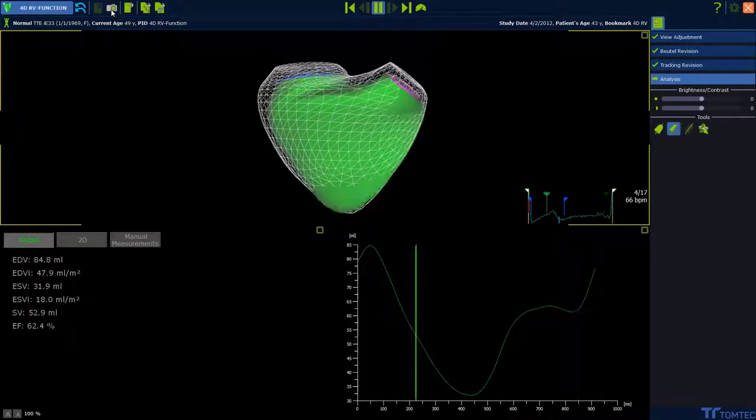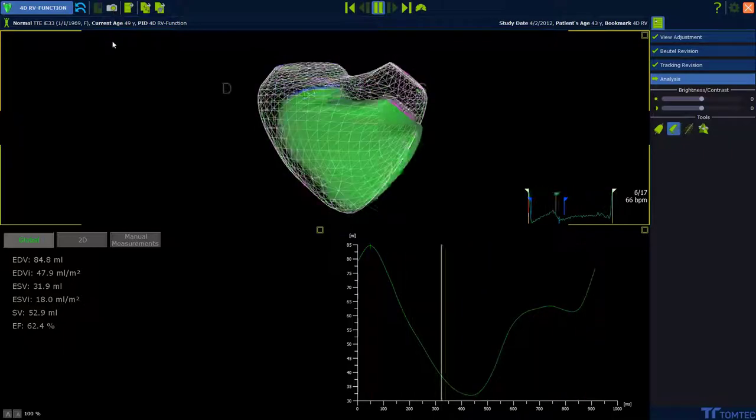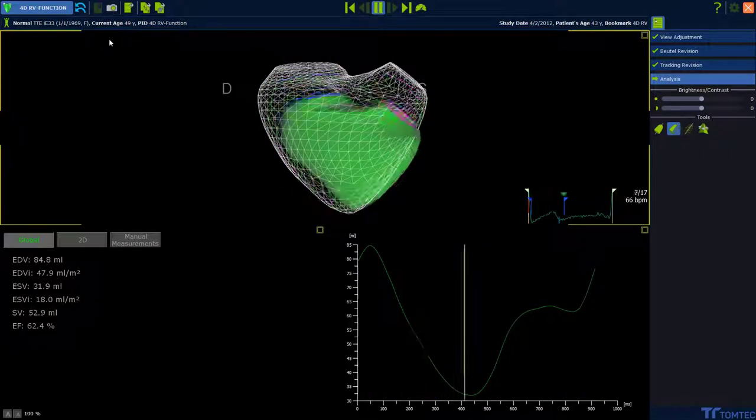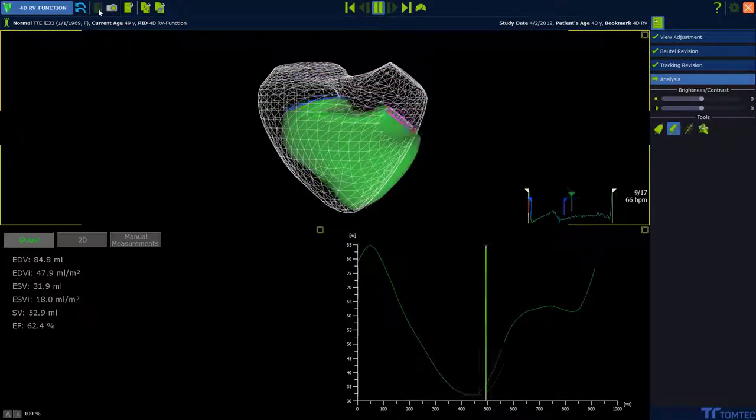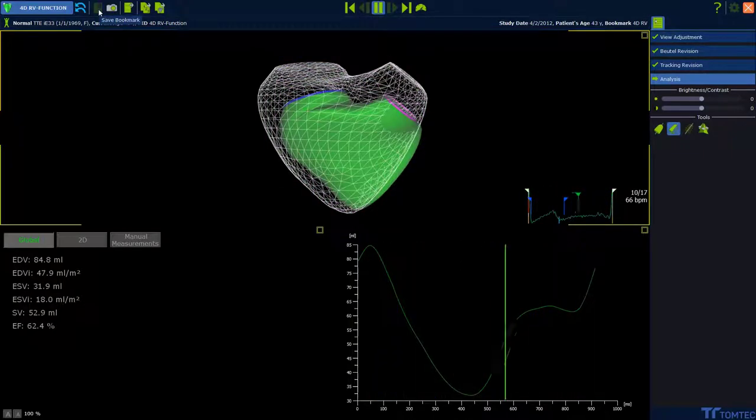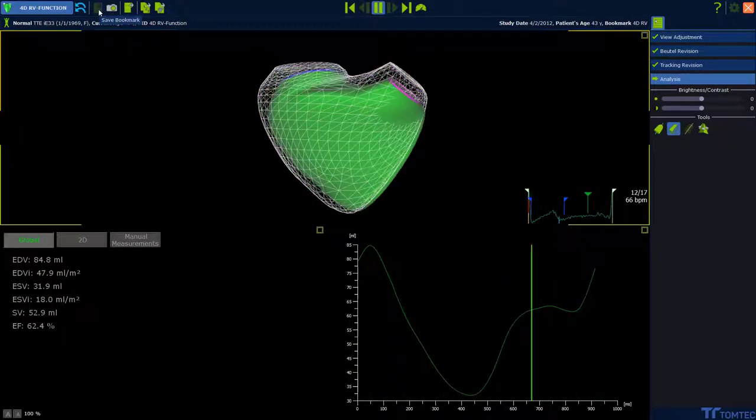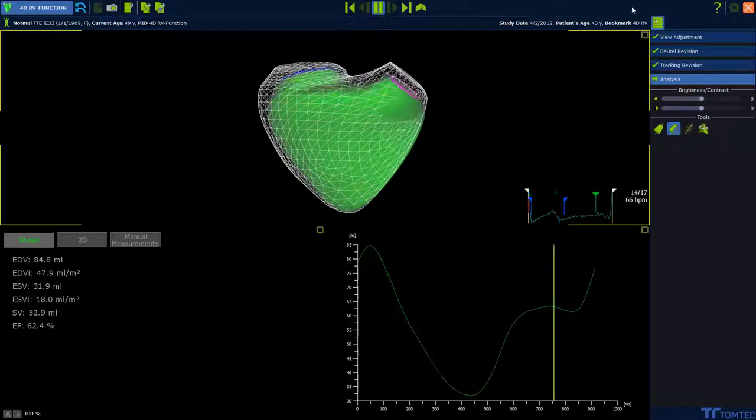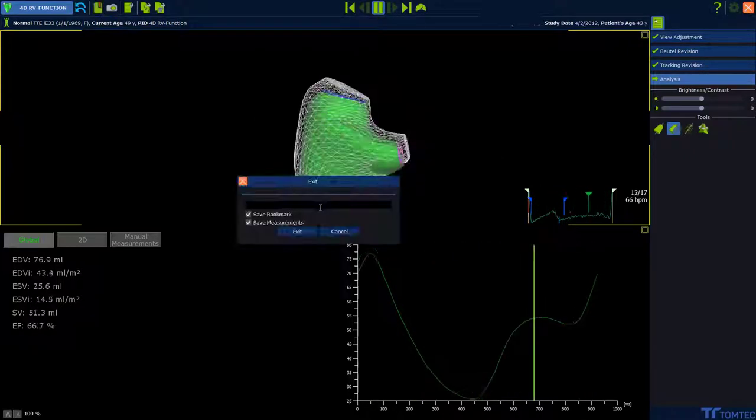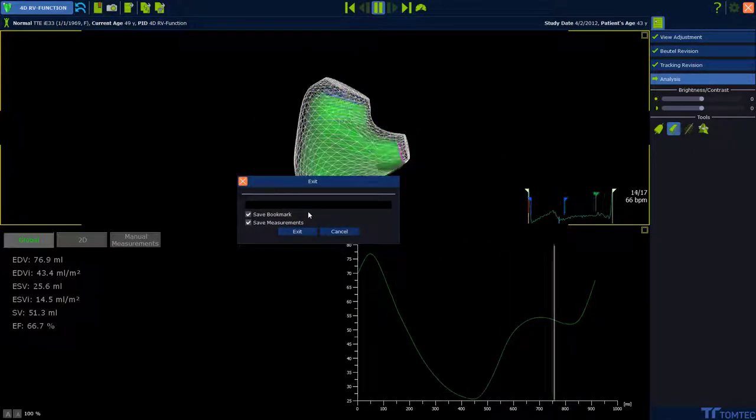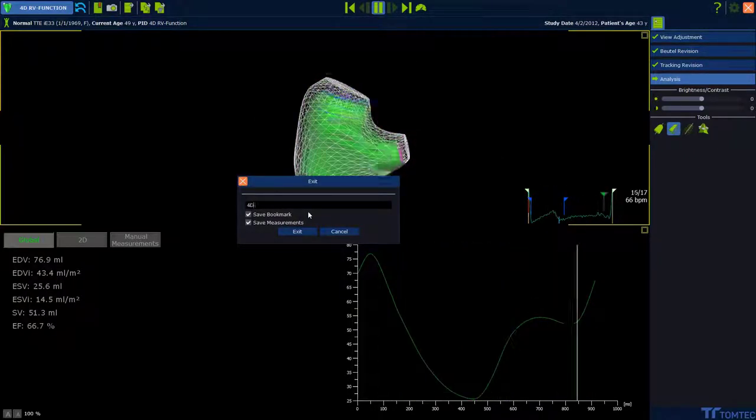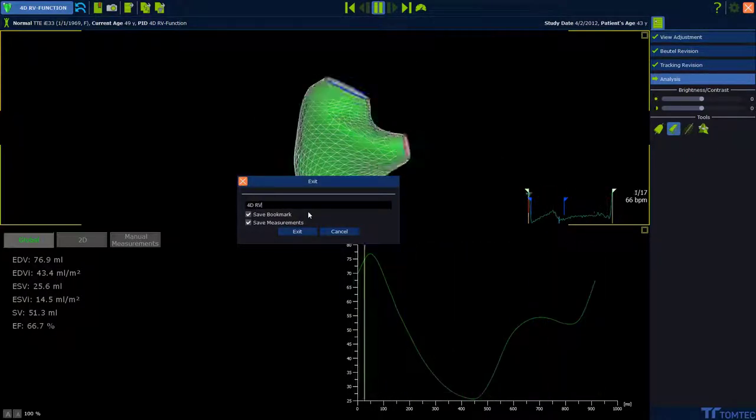The last button on the left side is creating a bookmark. We can also create a bookmark if we exit the application on the right upper corner. Type a name to relaunch it later on.